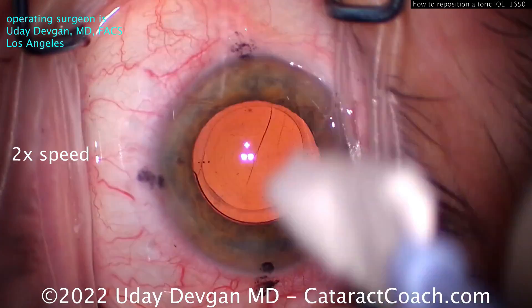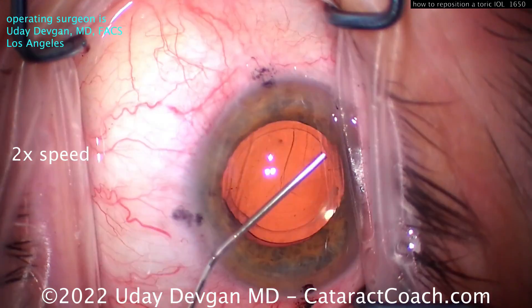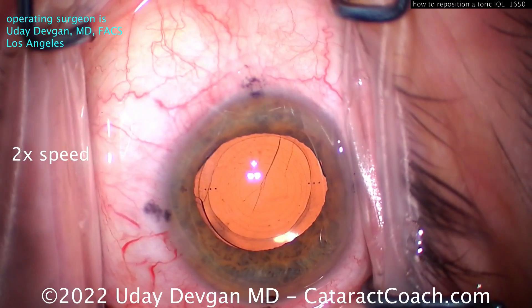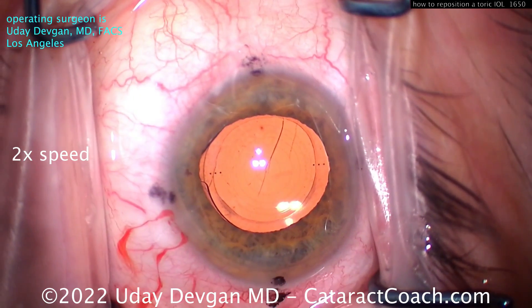We'll put a little anesthetic and now some viscoelastic in the eye. But very importantly, do not overfill the eye. Fill about 50 or 60 percent — that's it — because we're going to use more viscoelastic to separate the lens from the capsule bag, and you don't want the AC to be highly pressurized.